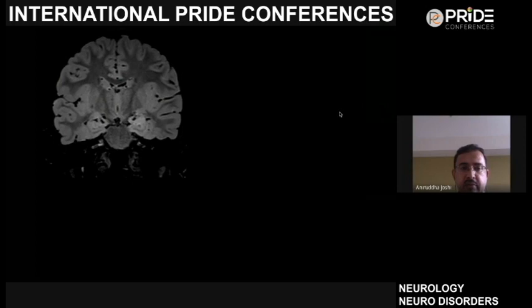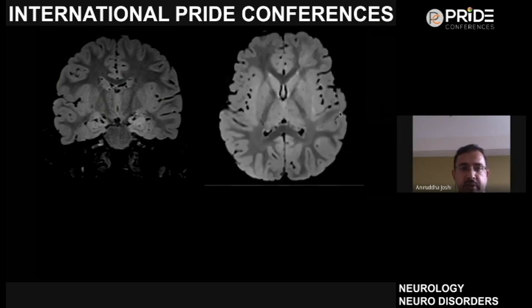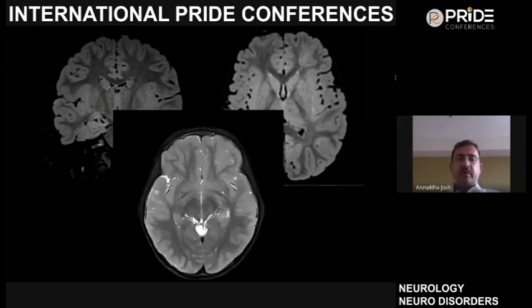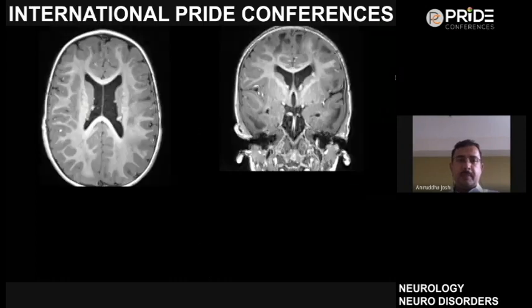So a similar case of left hippocampal atrophy, but there are associated findings in the left temporal lobe. There is a white matter paucity seen, which is confirmed on T2 axial images. This is a transmantle sign. There is a large dysplasia in the left inferior frontal lobe. So a few findings, mainly the syndromes which are commonly seen.